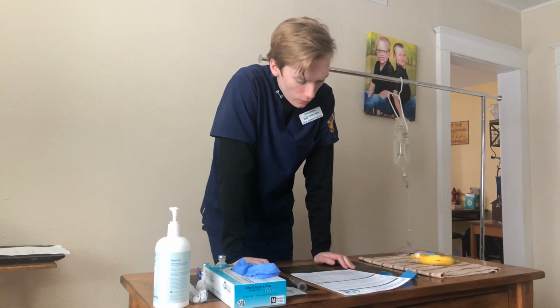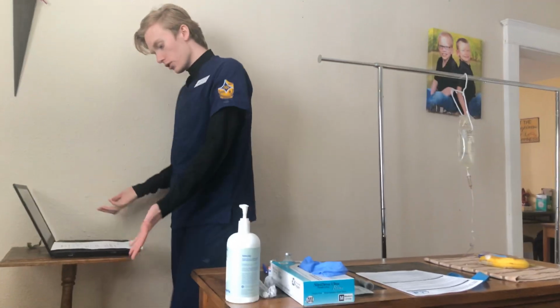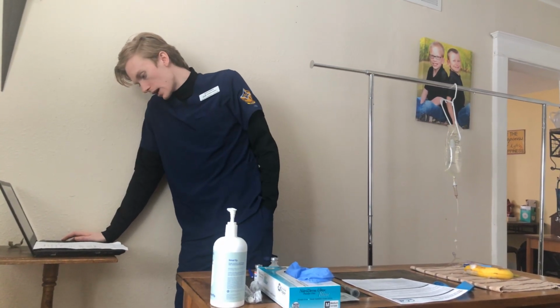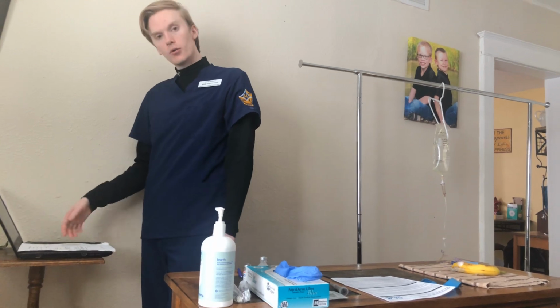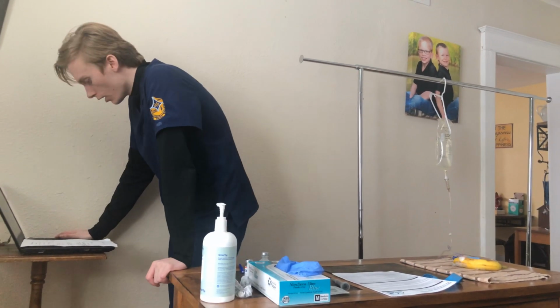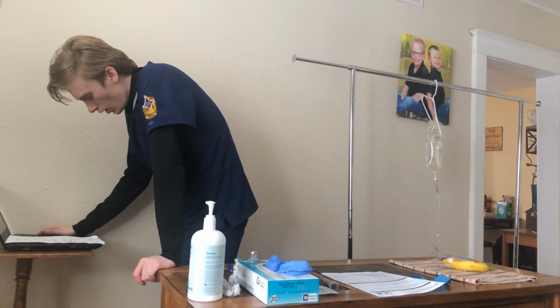So to start, we're going over to the MAR and ensure that we have an order, which we do. It's give Dilaudid 2 milligrams IV push every 2 hours as needed for complaint of pain related to coughing. Now that we have our order, I'm going to again check that the order on the computer matches my hard copy order, which it does. Everything is accurate. We have the right patient, drug, dose, time, route, and documentation.